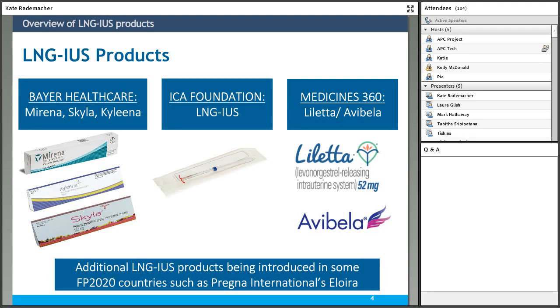So you can see here on this slide some of the LNG-IUS products that are currently available. On the left, as Mark noted, Bayer Healthcare manufactures 3 LNG-IUS products, Mirena, Kyleena, and Skyla. Over the past few years, FHI 360 has collaborated with partners and conducted market assessments for the LNG-IUS in Kenya, Zambia, and Nigeria. Through that work, we've documented that Mirena is available on a very limited basis in some private clinics in urban settings and priced anywhere between US $60 and $400, including the cost of insertion.